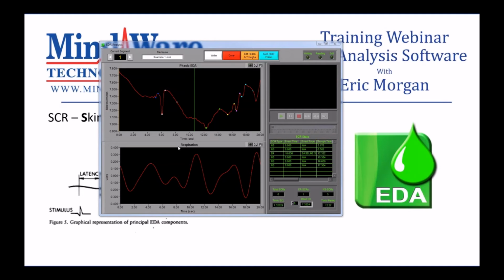Below, we see our respiration. So this is our respiratory signal, and here it looks very clean, but if it weren't, we could possibly consider that artifact has resulted in both artifact in respiration and artifact in the EDA signal. But here it looks good.